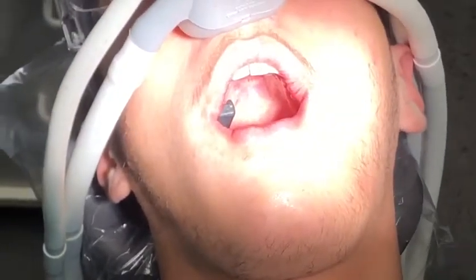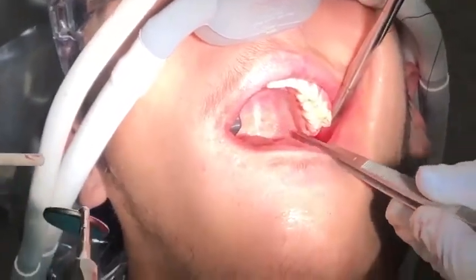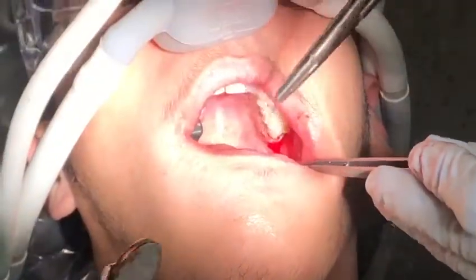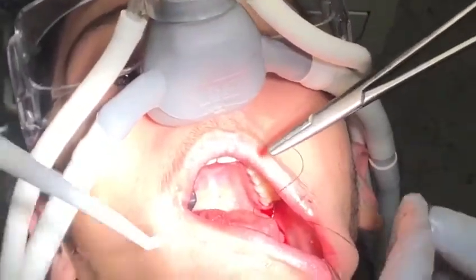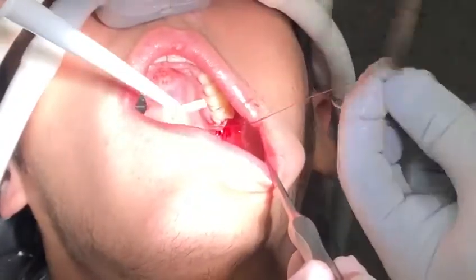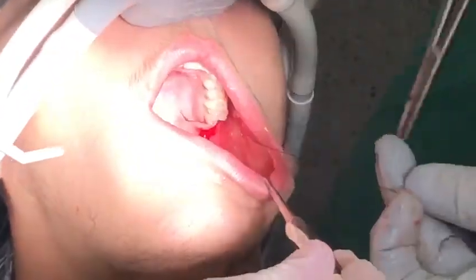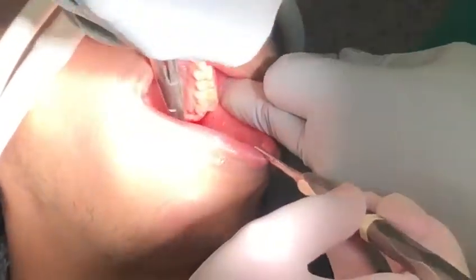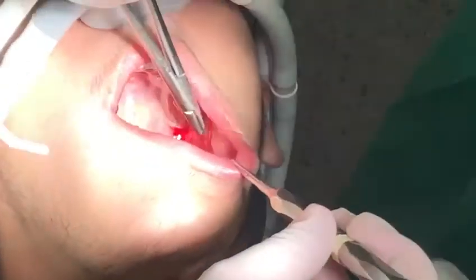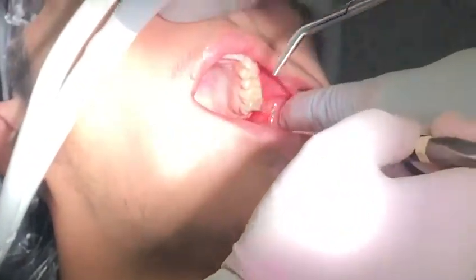Okay, let's close this up for you — there you go. Rest down, and I'll clean up a little bit. Thank you. Very good. Very good. Okay, thank you.